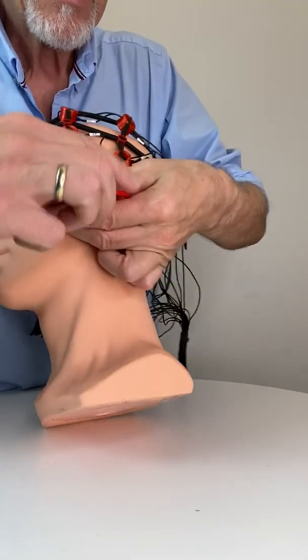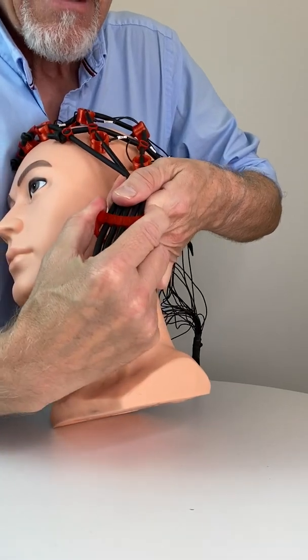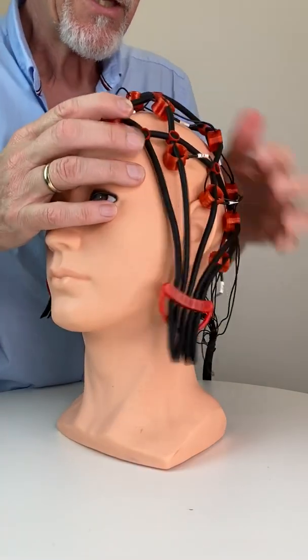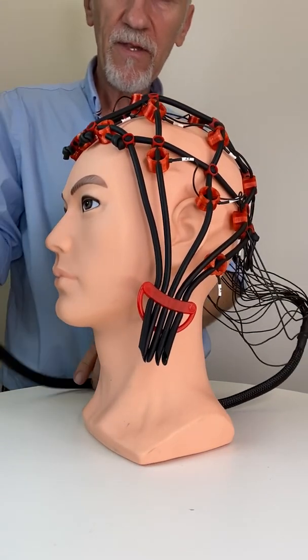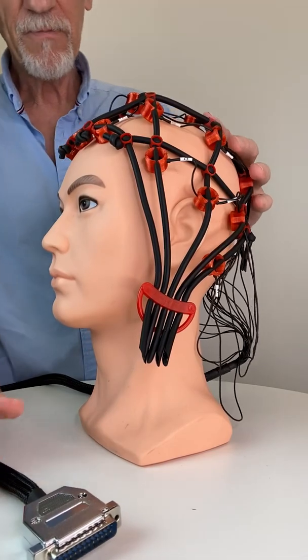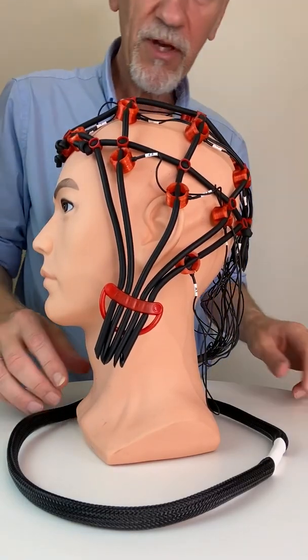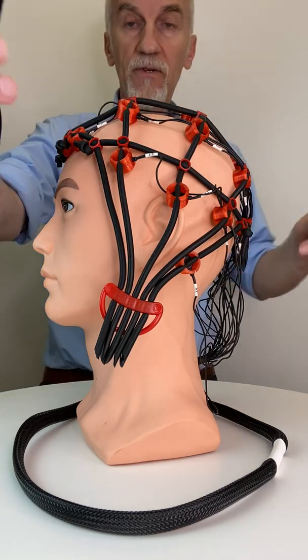Do the same on the other side — a little bit more. Now make sure the tubing is always over the shoulder of your client. Now we place the chin strap, which is here.